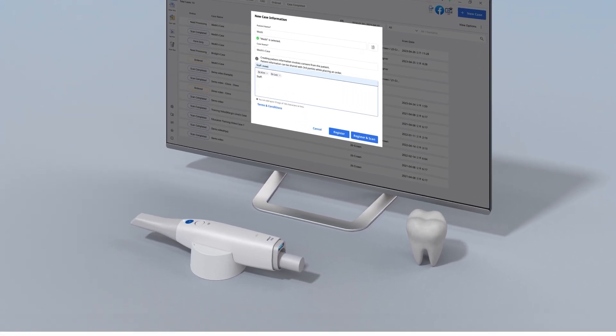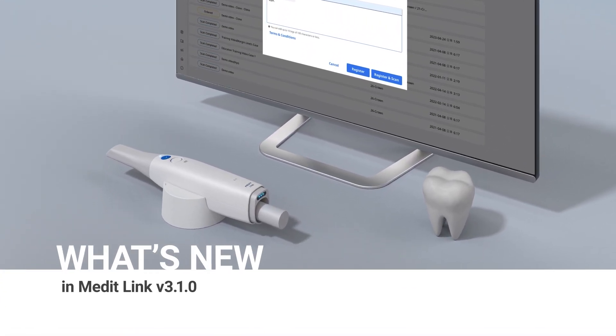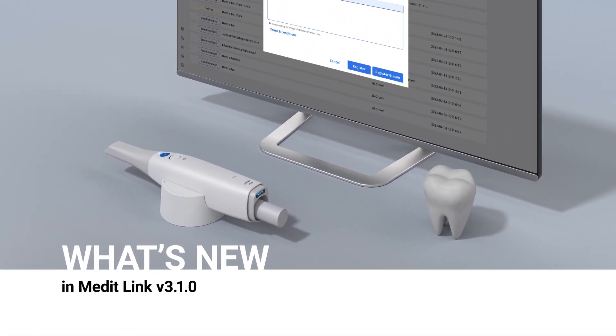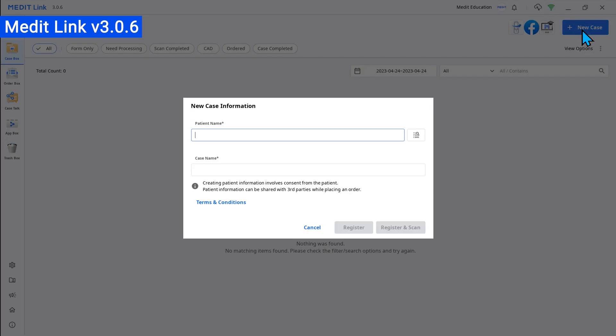We'd like to introduce the updated version of MeditLink. Let's start with the new features.